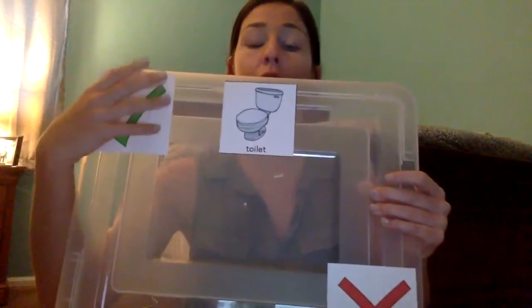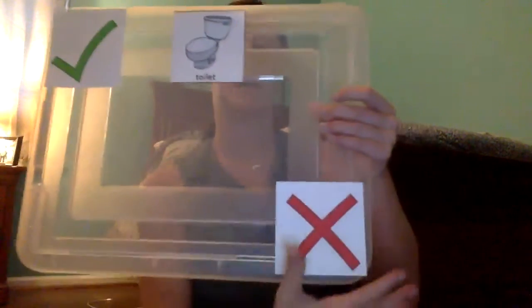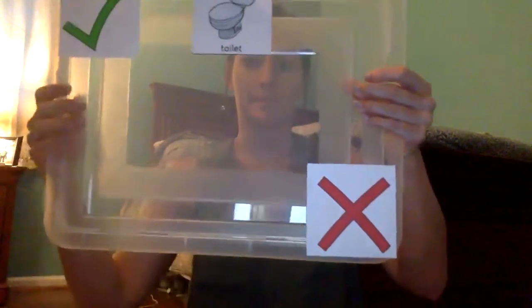As a special education teacher, there are activities that many of my students must always have forethought and direction. Sometimes this is most difficult for those nonverbal students, such as John. My low-tech device can be customized to ask him if he needs to go to the bathroom after completion of a lesson or activity. It is a simple yes or no, but it still would be utilizing the eye gaze and head motions to indicate if he needed to use the facilities, located in the upper left, or if he did not, located in the lower right.